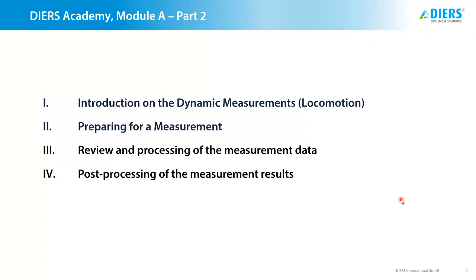Now, this presentation has been divided into 4 sections, where we will first have an introduction on the dynamic measurements, why to use them, how to prepare for a measurement, review and processing the measurement data, and post-processing the measurement results if necessary.